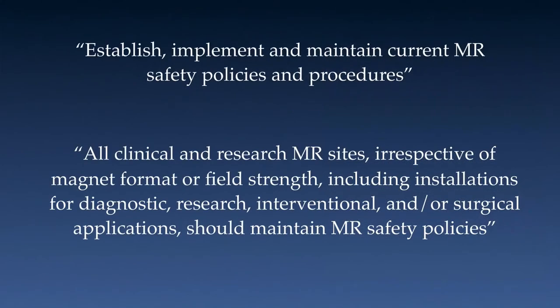All clinical and research MRI sites, doesn't matter the magnet format or field strength, and this includes installations for diagnostic imaging, research, interventional, or even surgical applications, all should maintain MR safety policies.